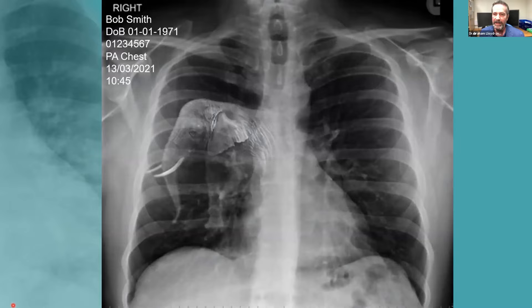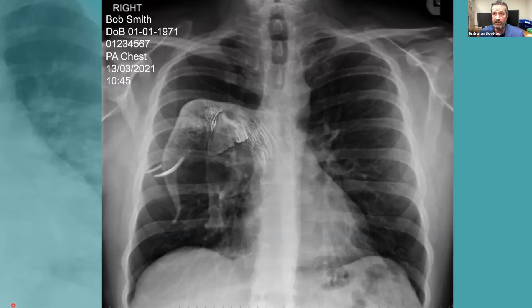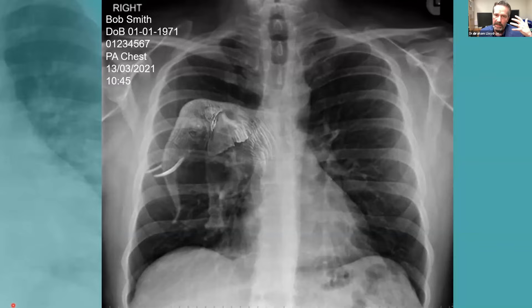I've deliberately given you an image with a diagnosis you've never seen before so we can go through the systematic approach without getting distracted by a specific disease entity. You're going to want to talk about the elephant in the room as soon as you can, but you have to get checklist points first. First, identify the image — say 'This is a plain chest radiograph, PA view, taken of Bob Smith, date of birth 1st January 1971, hospital number 01234567, taken on 13th March 2021 at 10:45.' You know you're going to say those words before you go in — you don't have to think, you can speak those lines automatically.